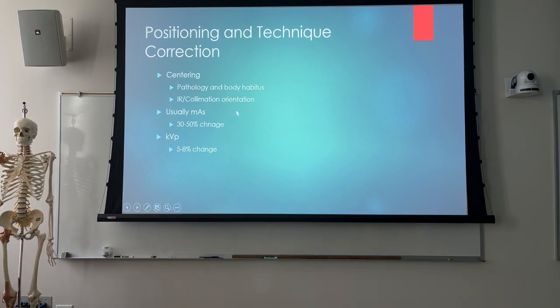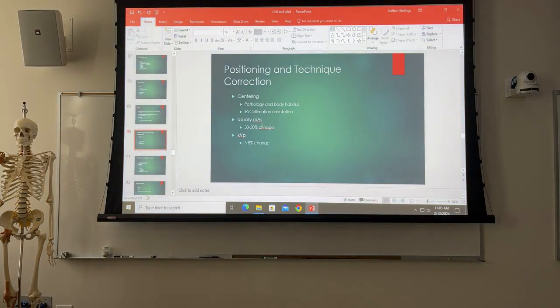Usually our mAs is going to be a 30 to 50% change, or a 5 to 8% change in kVp.